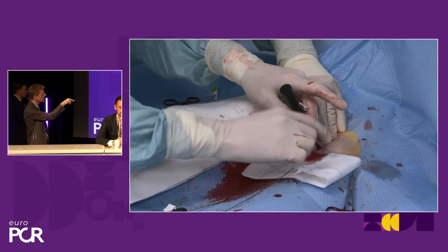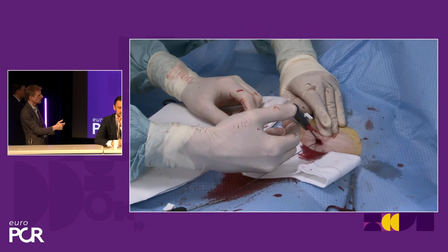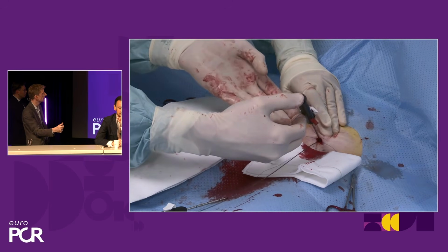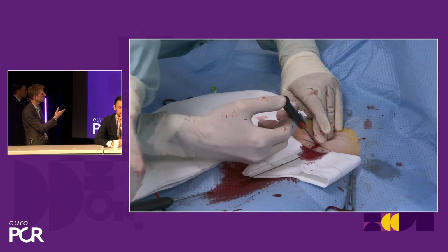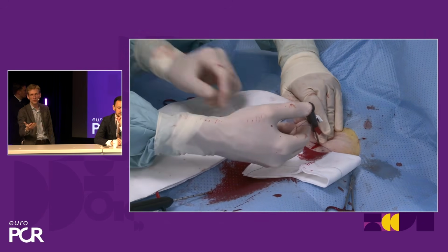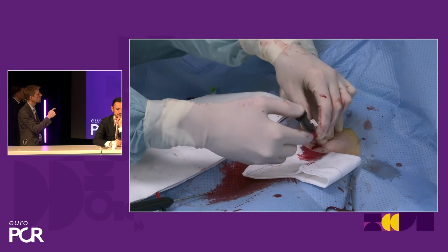Look here. You wrap it around your digit, and then from the same hand, you pull on your wire and you push on the knot. You push the knot really down, and now it's already quite nice, so it looks already closed. I don't think I have to supplement with anything else. So the wire goes out, and we repeat this on both ends.